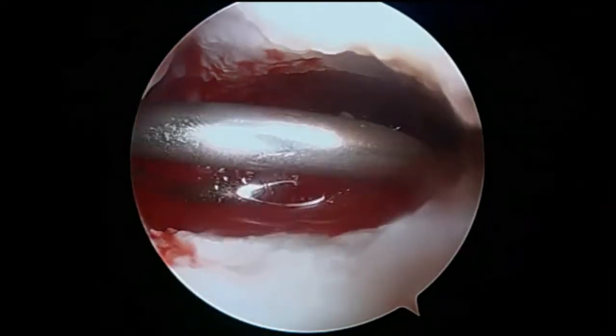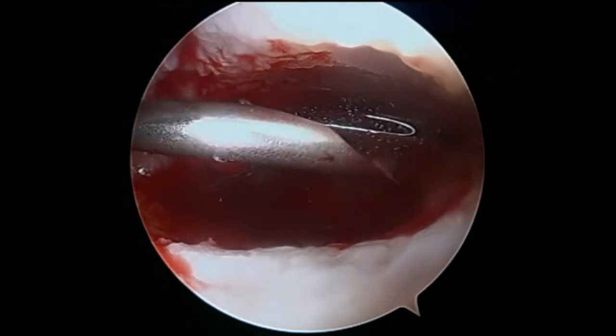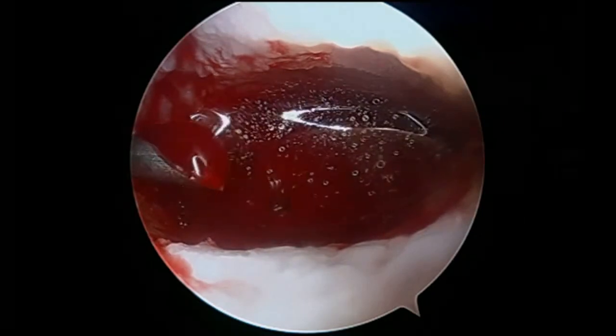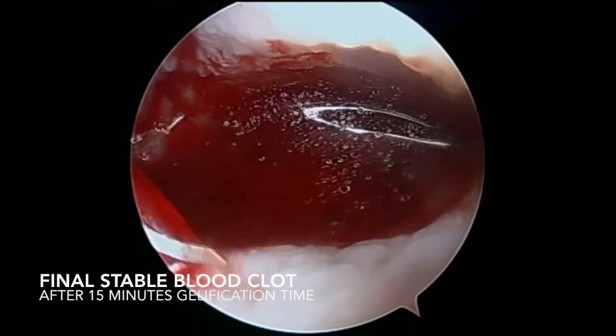Once we cover all the lesion area, the gelification process starts and it could take overall 15 minutes until we finally get the desired stable clot.